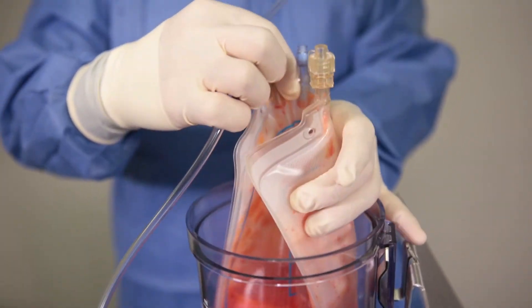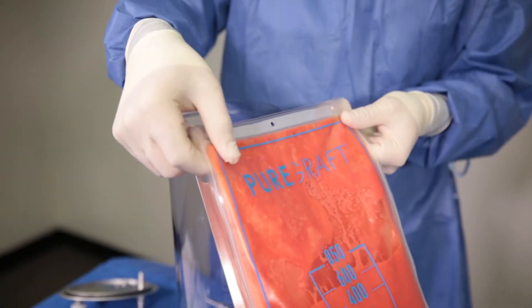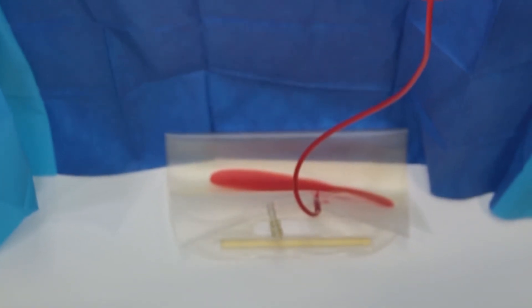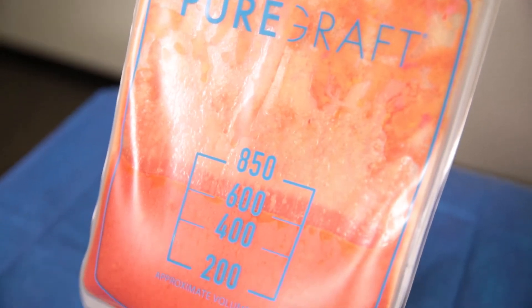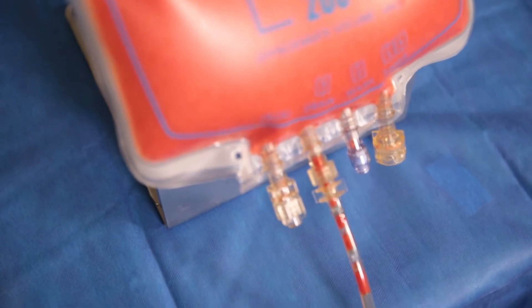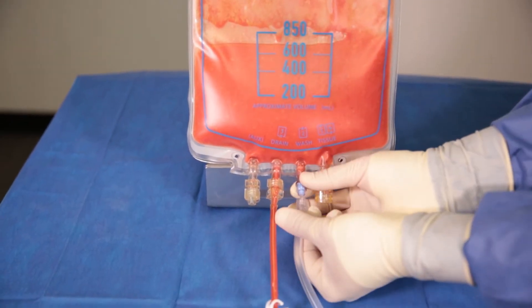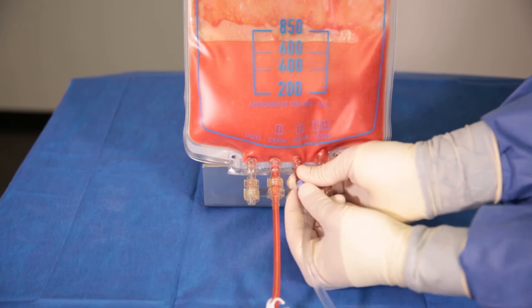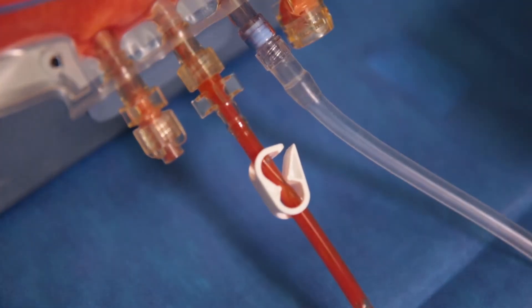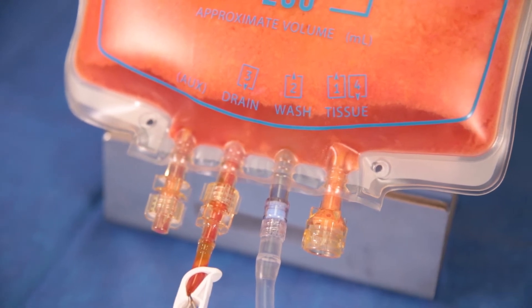Purge the air from the bag and then attach the drain bag. Attach the purification bag to the easel and place the waste bag on the floor. With the drain clamp open, the user should begin to see fluid draining into the waste bag. By now, the circulating nurse will have replaced the tumescent bag with one liter of Lactated Ringers, and the scrub tech can attach the tumescent tubing to the wash port on the PureGraft 850 bag. Before adding Lactated Ringers, clamp the drain line and then introduce about 450 milliliters of fluid into the bag.